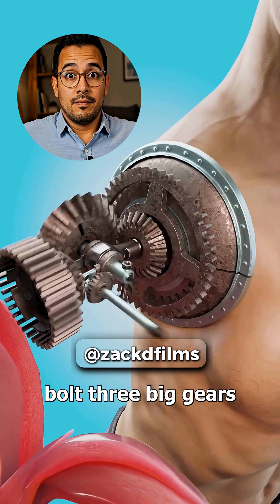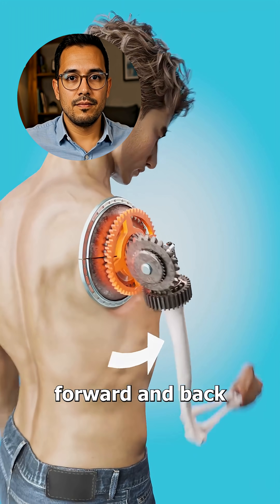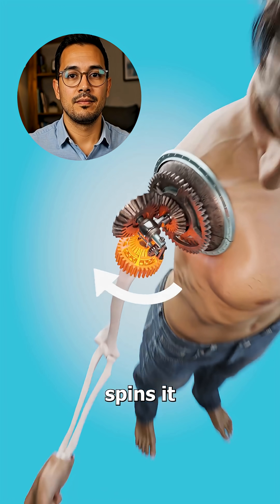Once you strip away your muscle, bolt three big gears into your shoulder. One makes your arm swing forward and back, one lifts it out side to side, and the other spins it in a circle.